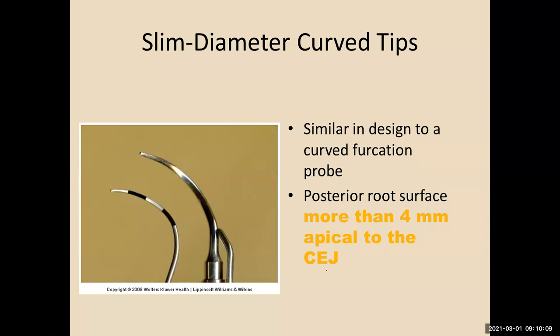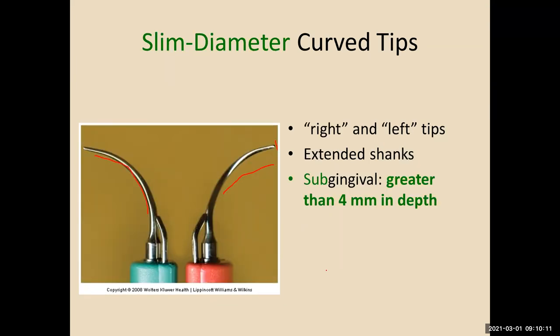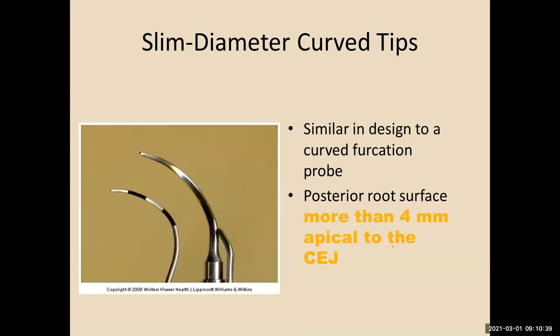So if you do not have a 4 millimeter or larger pocket, then you can use the universal and you don't have to use the right and left? Correct. Well, if they have root surfaces that are exposed too. Now, if they have recession, you should be working on the right or the left, because what's going against the root surface is this area here, instead of the point, because you can gouge the root surface with that point, the tip.